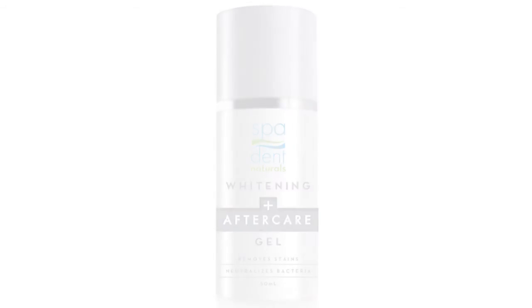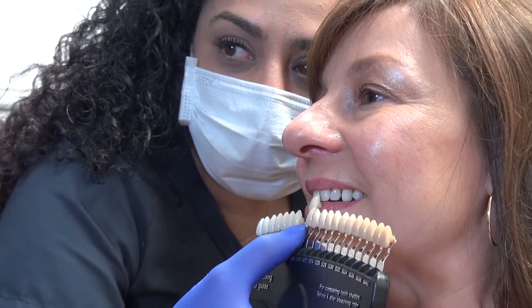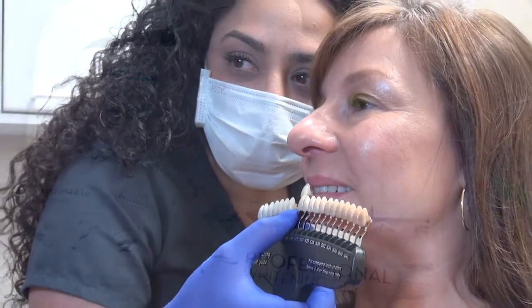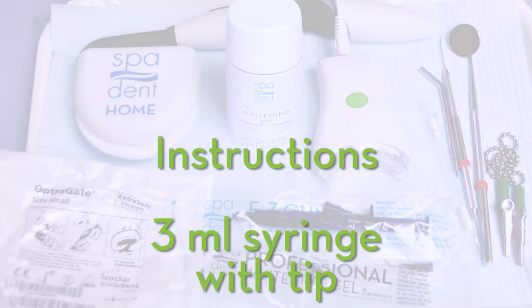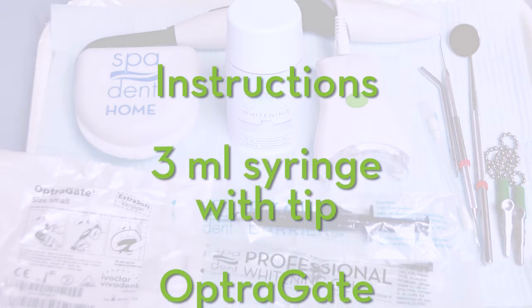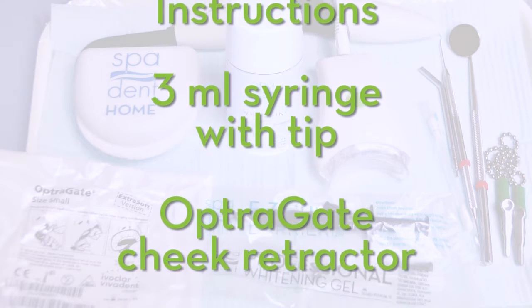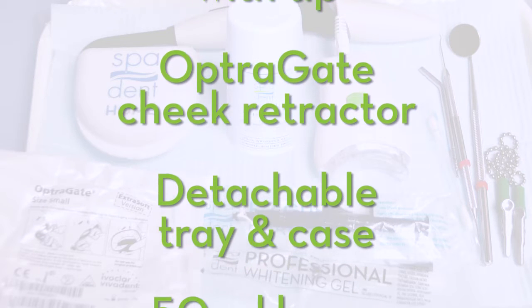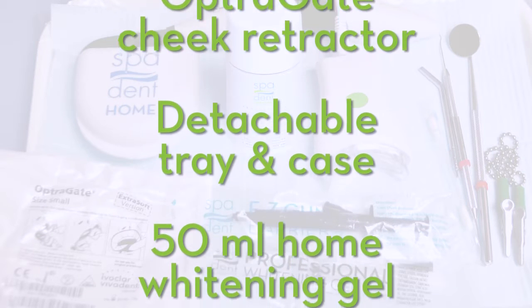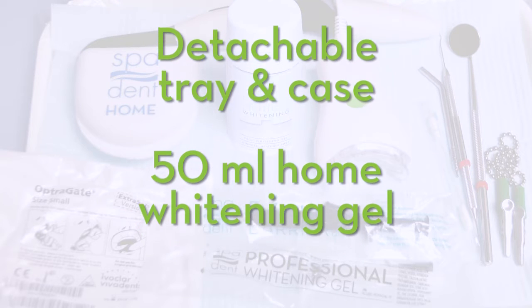Your patients will thank you with a smile and look forward to their next hygiene appointment. Included in your Boost Brightening kit, you'll find detailed instructions, one 3 milliliter whitening gel syringe with tip, an OptraGate cheek retractor, detachable mouth tray and case, and one 50 milliliter pump of home whitening gel.